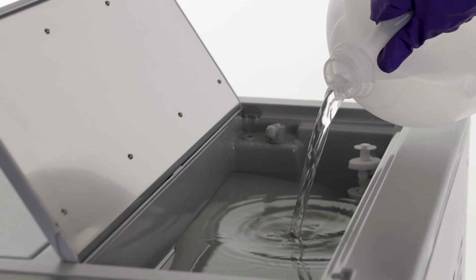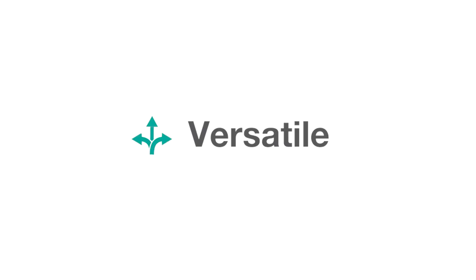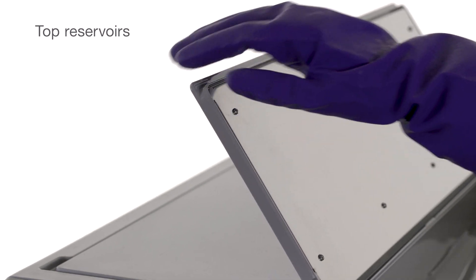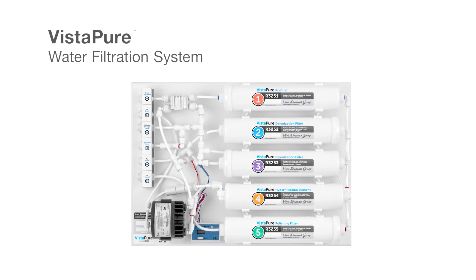Fresh water is used in every cycle, which reduces the build-up of oils and debris. StatClave offers a number of filling and draining options including easily accessible and cleanable top reservoirs, front manual fill, and a rear fill option that can be connected to the VistaPure water filtration system for automated filling.